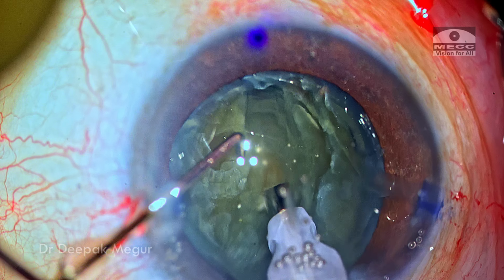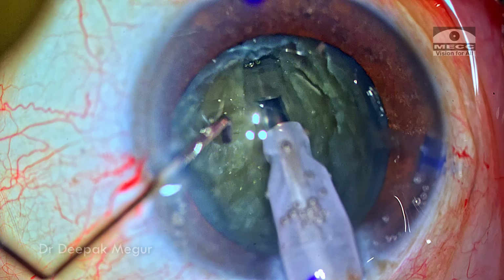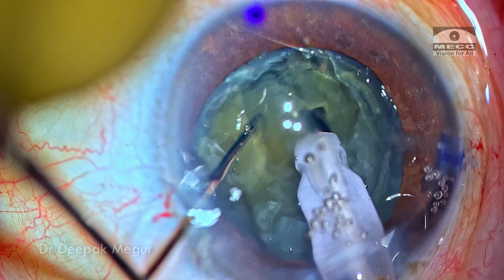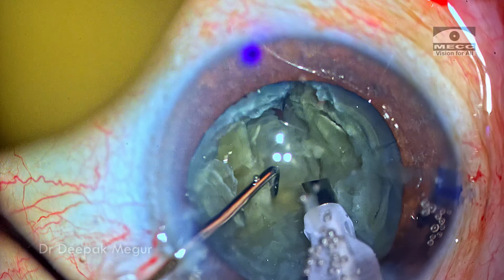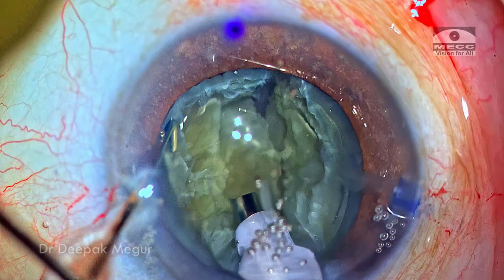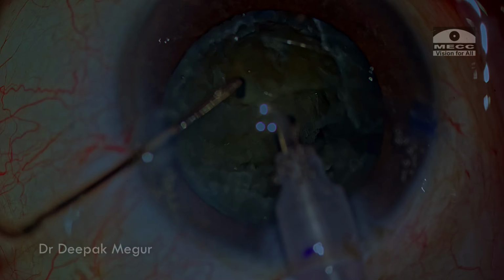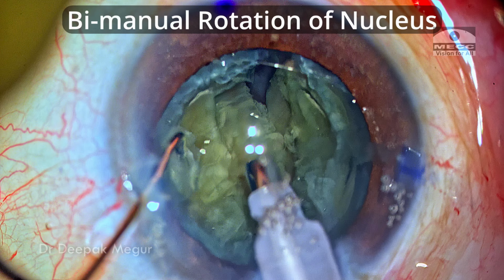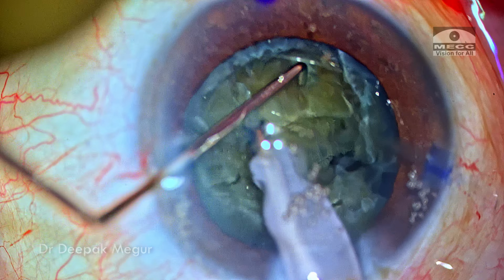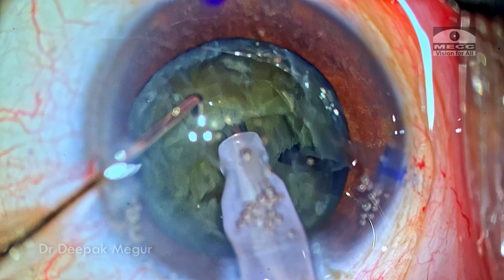And once I've reached about 60% depth, I think this should be adequate to split the nucleus into two halves. The nucleus could be split easily. And I'm trying to rotate the nucleus so that I get the heminucleus into the right position. And please watch, I'm going to use the bimanual technique of rotating the nucleus, wherein the dialer and the phaco tip act together to move the nucleus. This is a better way to minimize any stress on the zonules.